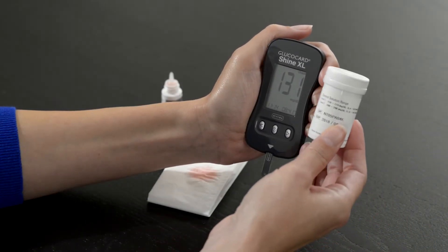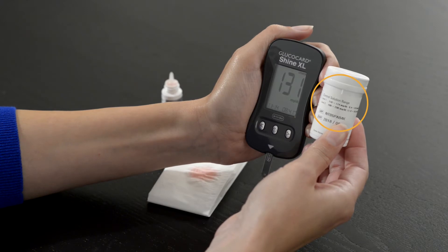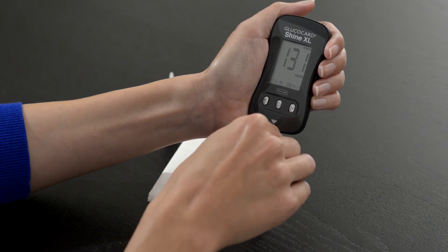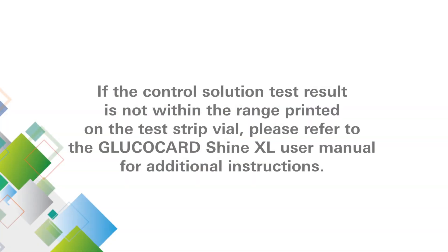Compare this result with the control solution range printed on the test strip vial. The result should fall within that range. Remove and dispose of the test strip. If the control solution test result is not within the range printed on the test strip vial, please refer to the Glucocard Shine XL user manual for additional instructions.